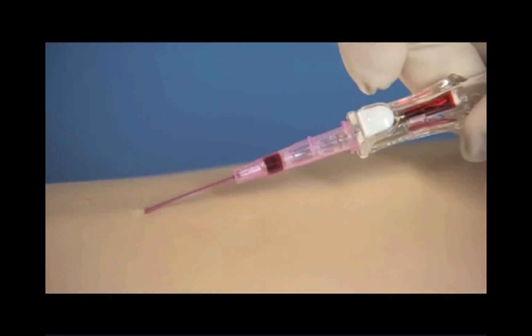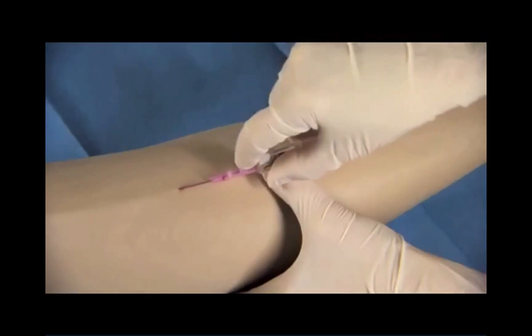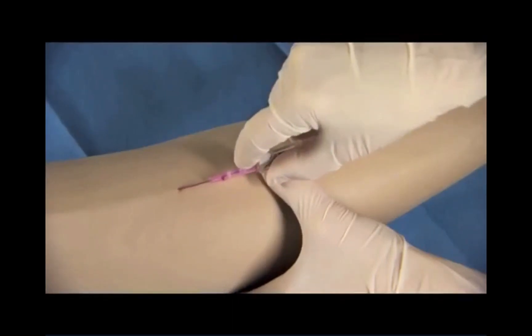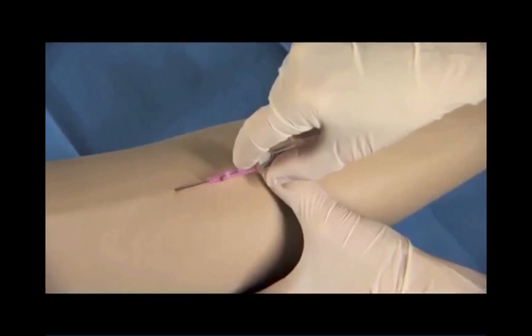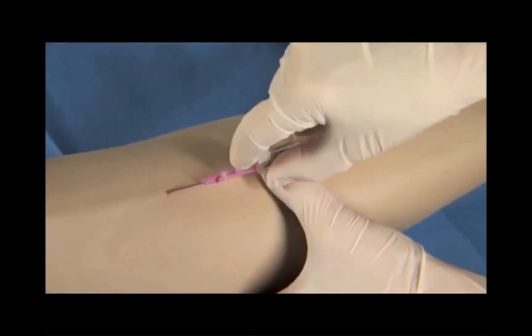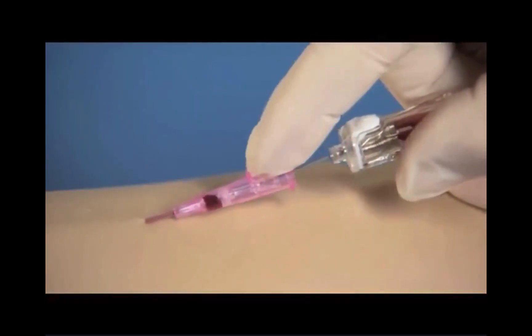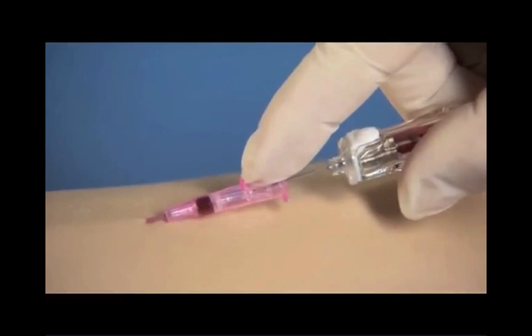In 18 gauge and larger, blood return will be only in the flash chamber. Once you see blood return, lower the catheter angle and advance the entire catheter and needle unit slightly. This ensures the catheter tip, and not just the needle tip, is within the lumen of the vessel. While stabilizing the vessel, push the catheter off the needle and into the vessel. Avoid pulling back on the needle.